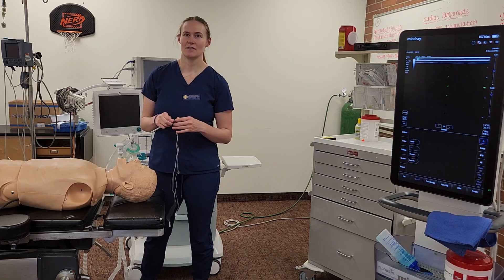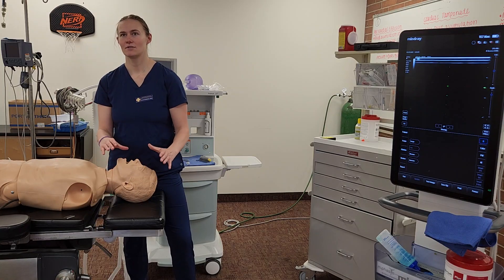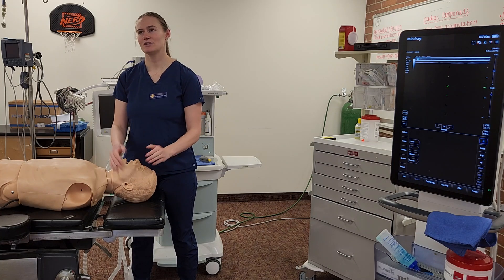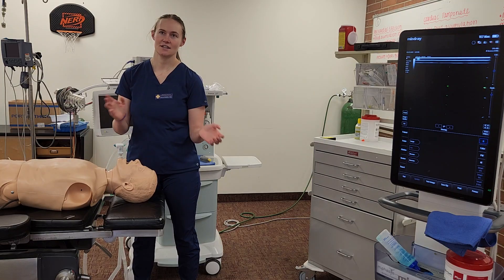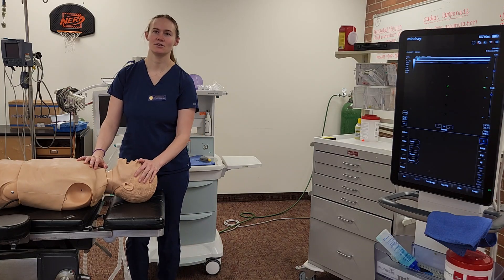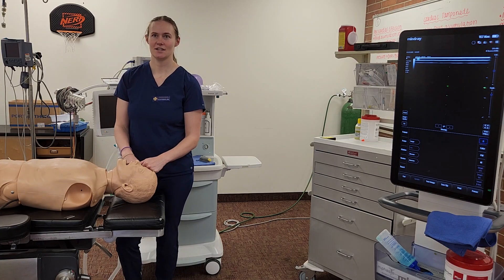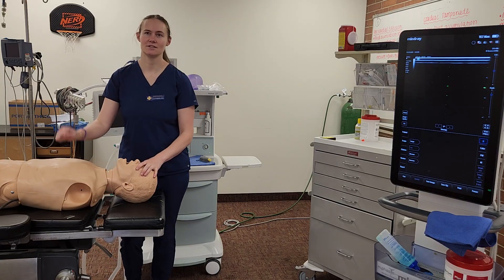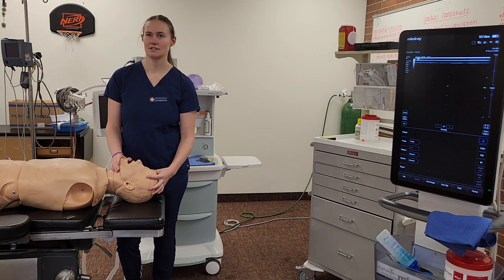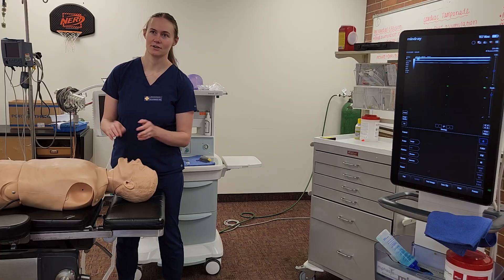We're using Versed for sedation and local anesthetic meds. Then I can go meet my patient with my room set up. I'll do an interview and find out they have no significant medical history, no chronic medications, no anesthesia history, no allergies. Their NPO status is acceptable for the case, and they are ASA 1. All labs are within normal ranges. I'll verify labs: CBC, BMP, PT/INR, type and screen, and EKG. For the physical assessment, I'll listen to their heart and lungs, check mouth opening, inter-incisor distance, neck thickness, and make sure they can do chin to chest. And then I'll do a 3-3-2 assessment. I'll also check if they have a beard or if they can shave.